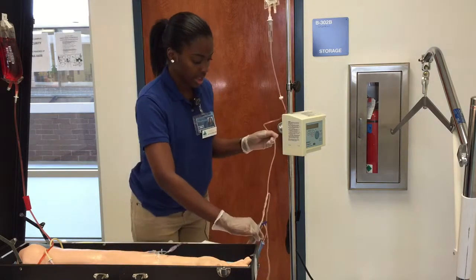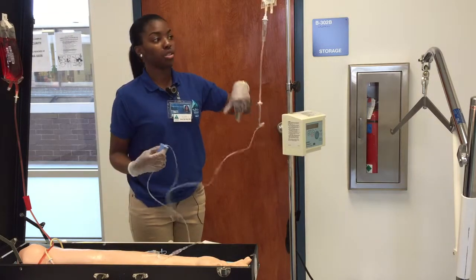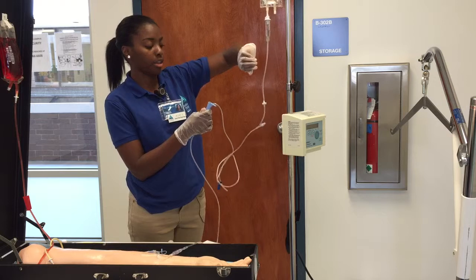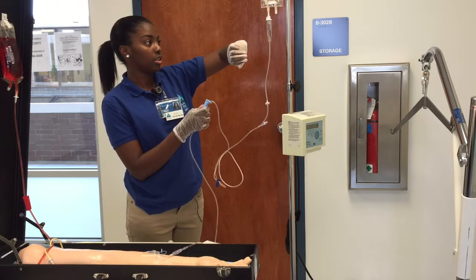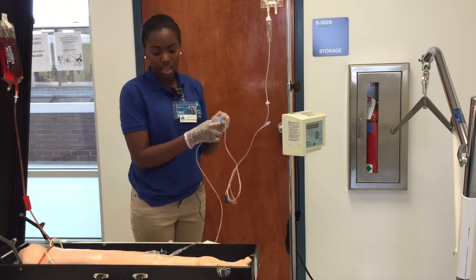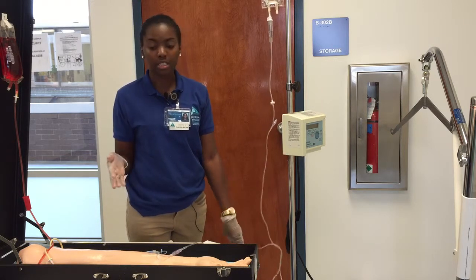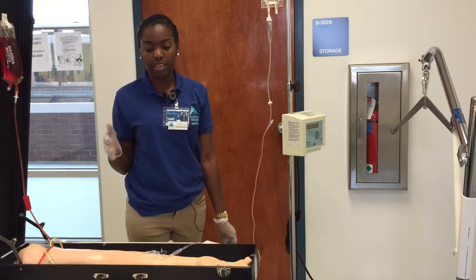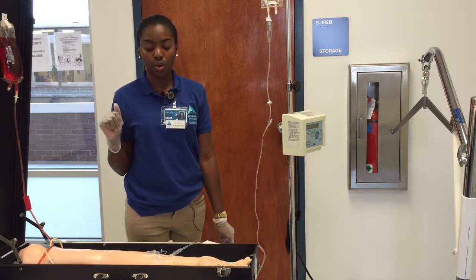and I have to establish my drop rate, which was 8 drops per minute. So I will do that now, slowly opening the clamp and looking at my watch. Okay, so the drop rate is set to 8 drops per minute, and I will let the infusion go on. And if the patient has not received the medication before, I will stay and inspect the IV site for 15 minutes. Then I'll come back when the medication has run its course.